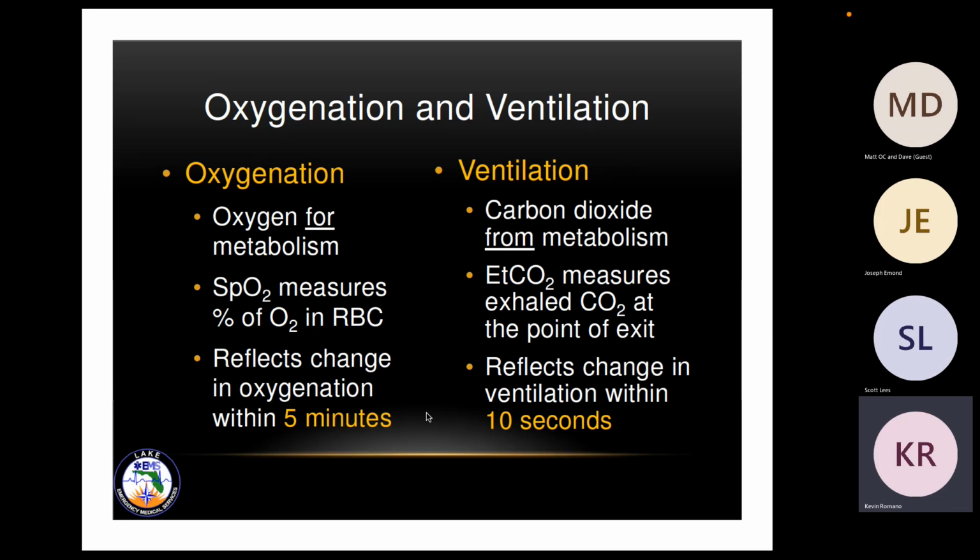Oxygenation is for metabolism. That's what oxygen is for. Versus carbon dioxide, this is from metabolism. Oxygenation is measured by SpO2, which is a percentage of oxygen in red blood cells. Under ventilation, end-tidal measures the exhaled carbon dioxide at the point of exit. Oxygenation reflects change within 5 minutes. Ventilation reflects change within 10 seconds. Okay, so we can see that change quickly, minutes before you'll see an SpO2 decrease when the patient becomes apneic.